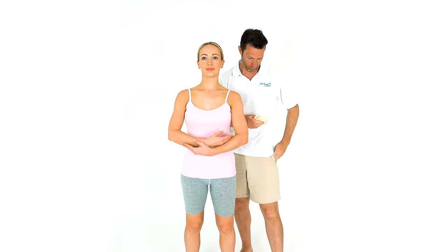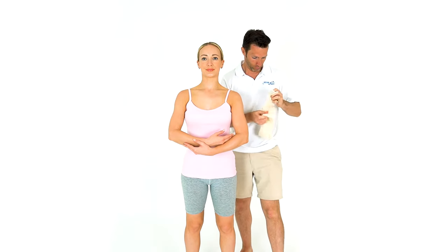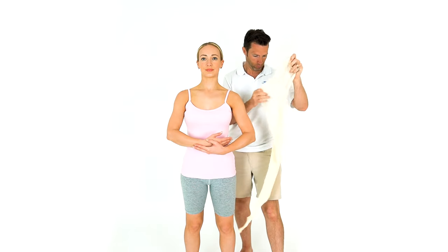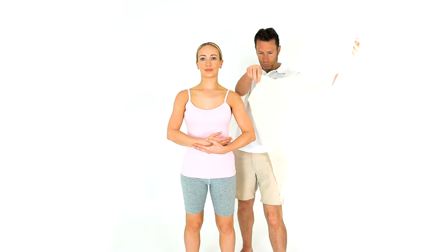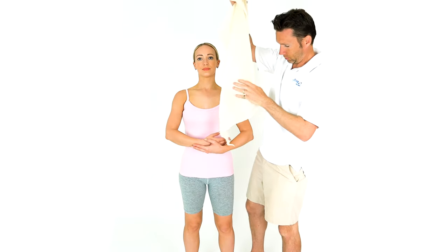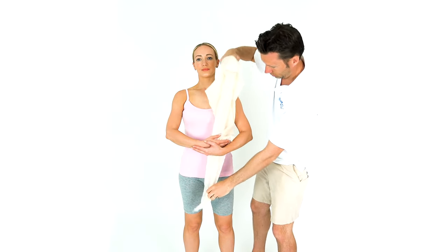Open the bandage from the packet. Line the long end of the triangle parallel to the body. The short end faces the elbow. Place the long end in between the arm and the patient's body and leave the long end over the opposite shoulder.